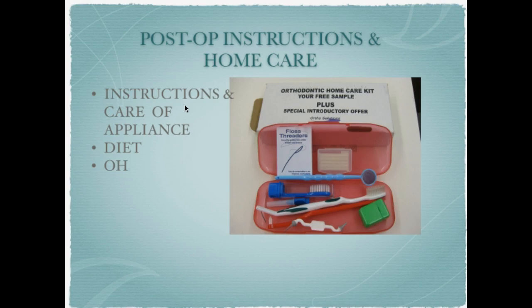Certainly, it's very important to review with the patient at each appointment the instructions and care of the appliance or any of the fixed orthodontic appliances that may be placed during treatment, care of retainers. Do you eat with them? Do you take them out? Do you sleep with them? All of those very important instructions.